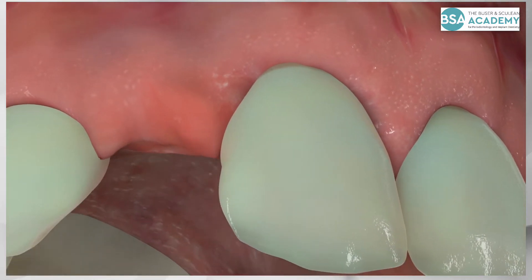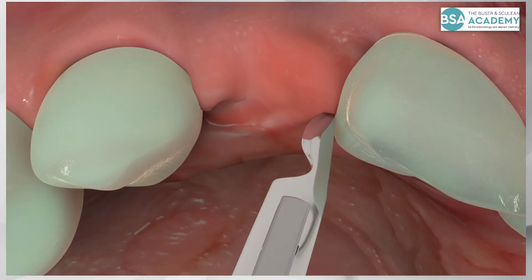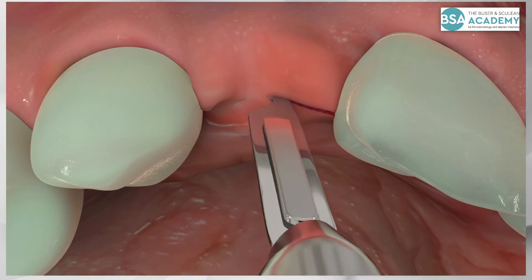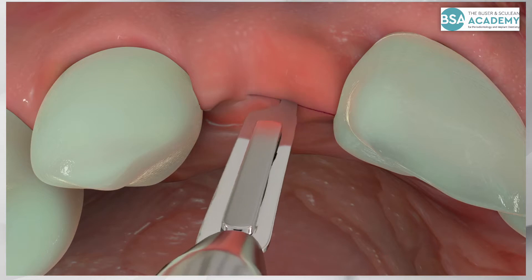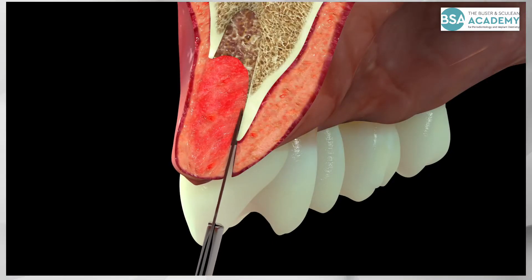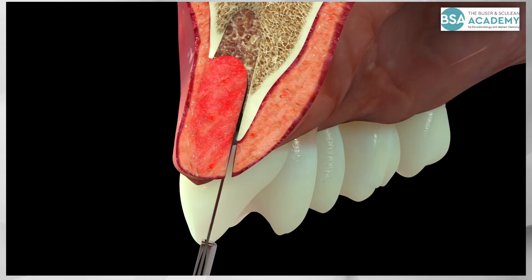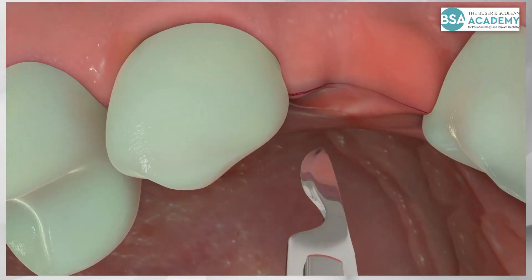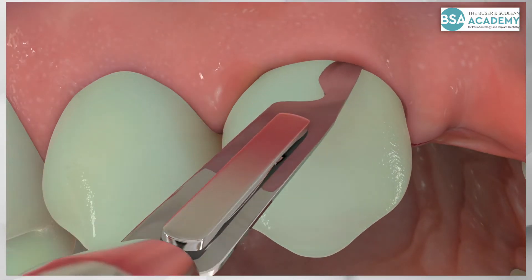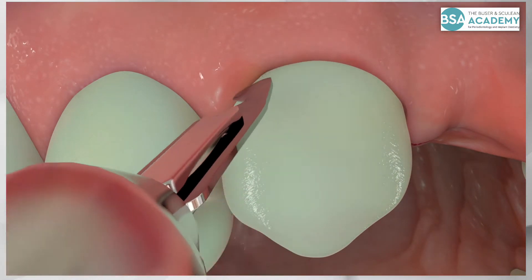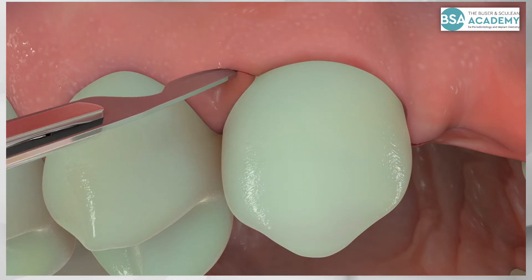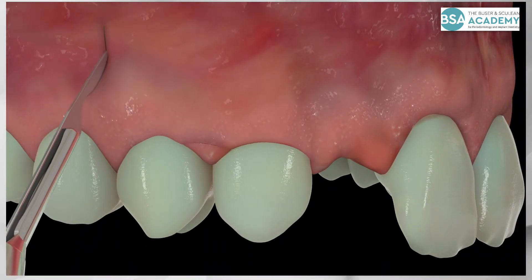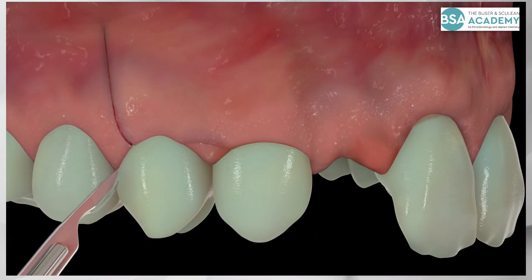Implant surgery is initiated with a sulcular incision at the adjacent central incisor, extended in the edentulous area in a slightly palatal position. The blade is inserted deep into the remaining socket along the inner palatal wall. The incision is continued through the sulcus of the adjacent lateral incisor, combined with a papillar-base incision and a vertical-releasing incision at the first premolar. The result is a triangular flap which offers excellent vascularity and eliminates the risk of a vertical scar within the aesthetic frame.